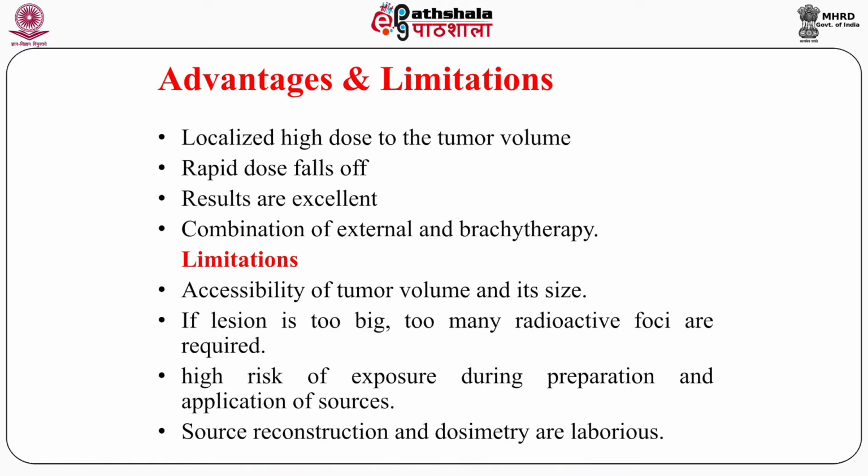The second limitation is that if the lesion is too big, too many radioactive foci are required. If the tumor is big, then we have to adjust the applicator in such a way that the source positions are many, and the treatment time will be very high in that case.